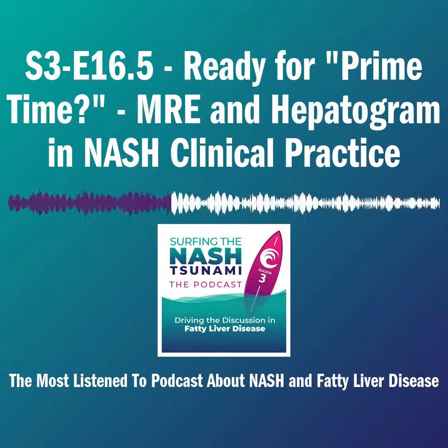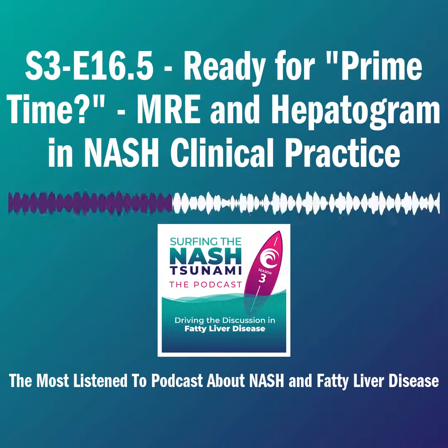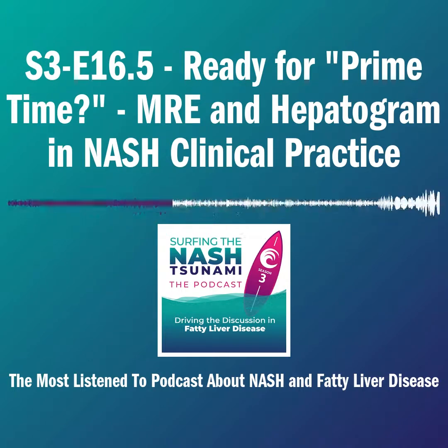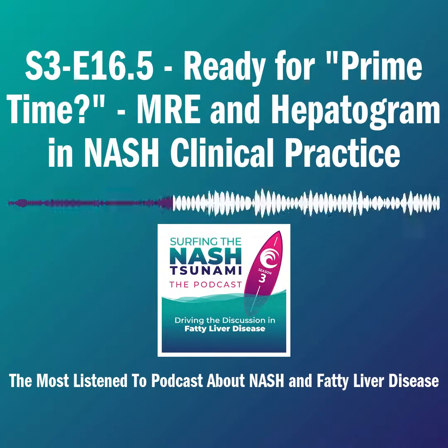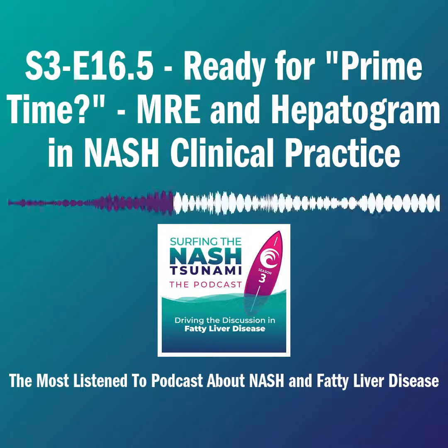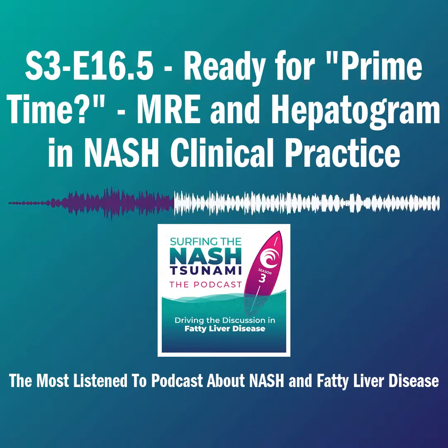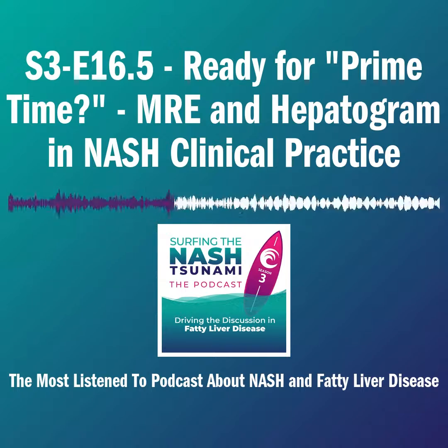And then about 3 or 4 years ago, there was actually a new CPT code for elastography as well. That cost is a little bit more, but not a lot. Medicare cost is under $300, a total technical and professional fee to do an elastography. And so we have dedicated protocols where we do elastography and we also do PDFF at the same time, and we charge for a PDFF. So that's just a little bit more expensive than an ultrasound, but that gives you an idea.